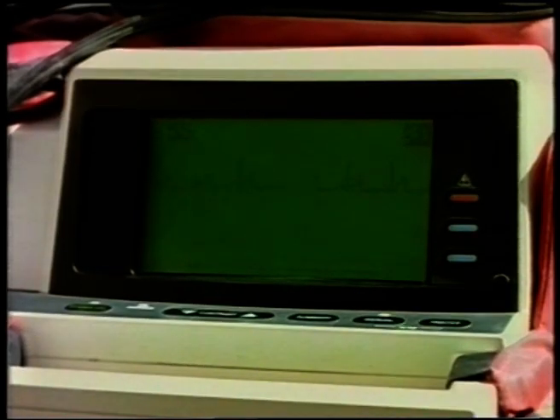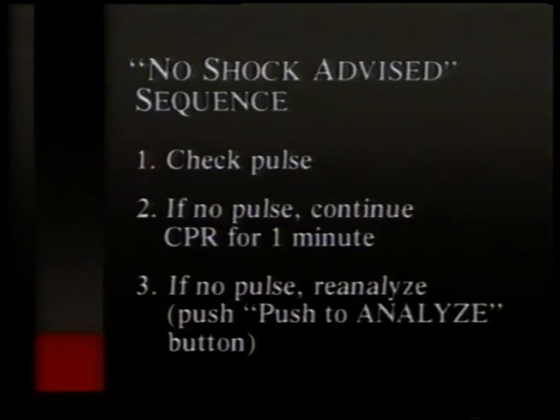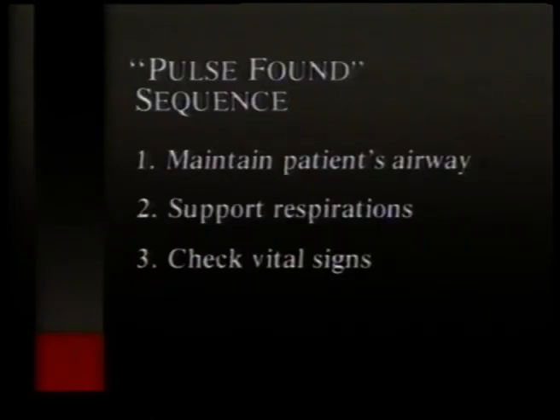If at any time a no shock advised message appears, the LIFEPAK 300's voice prompt will remind you to check the patient's pulse. Check for a pulse. If no pulse is found, perform CPR for 1 minute, and if still no pulse, reanalyze. After 3 no shock advised messages, repeat an analysis after every 1 to 2 minutes of CPR and proceed according to authorized medical protocol. As mentioned earlier, if at any time a pulse is found, maintain the patient's airway and continue to support respirations as needed, according to authorized medical protocols.